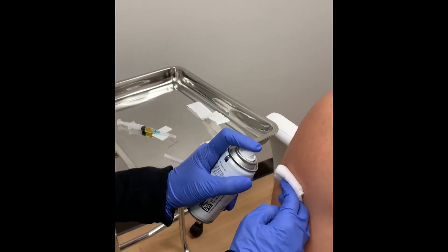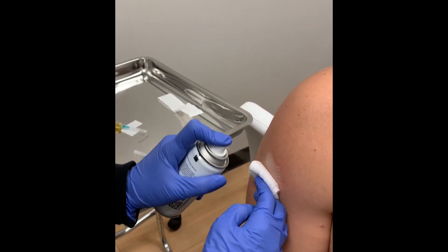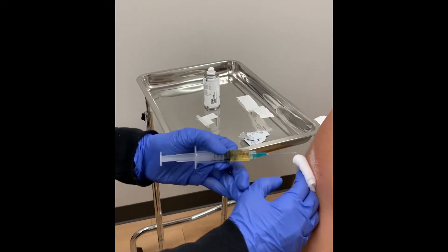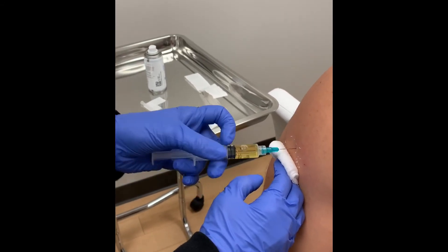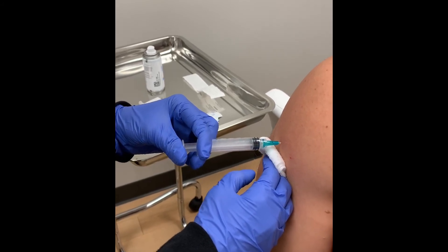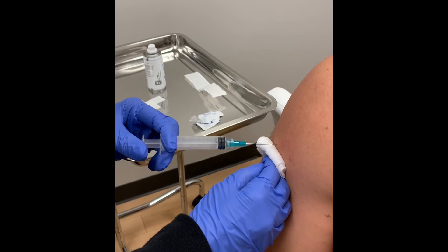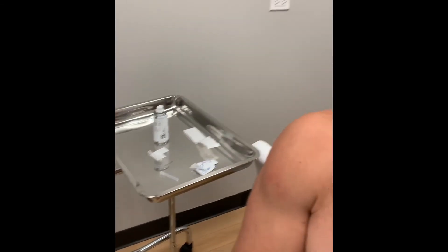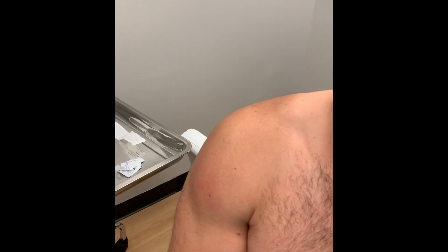If I wasn't videotaping, I'd help you out here. We got a versatile provider. This might hurt a little bit going into the muscle there. All right, barely bleeding. Done. Barely feel anything. And now the regenerative healing starts. Awesome. Congratulations. You don't even need a band-aid. We'll put one on anyway for sterility. Let us know how you do. I sure will.